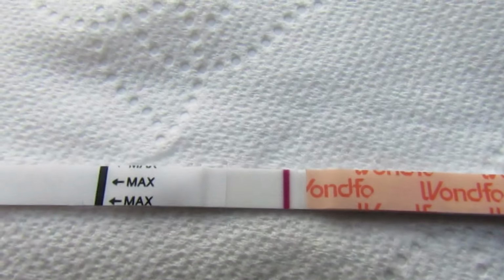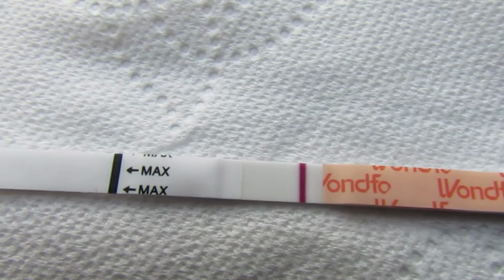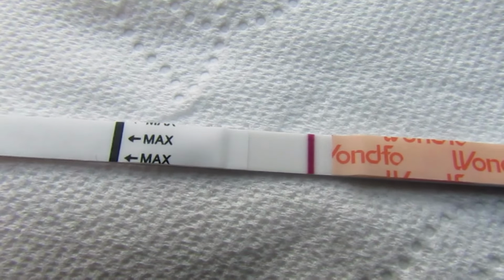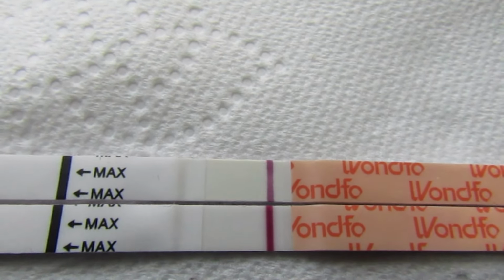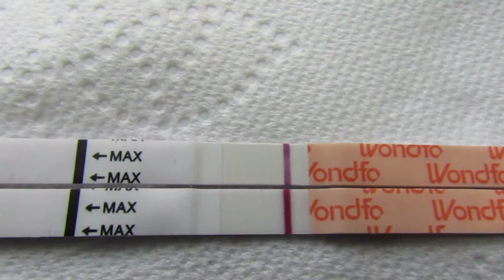Right, I can't say this view is any better. It's not cloudy outside, but the days are getting shorter and it just starts getting darker earlier. This is not a morning test either. This is an afternoon test. Alright, so here is the new test that I just took today. 8 DPO is at the bottom. I brought over my 7 DPO test and put it at the top. You can tell it's the test that's dried up right now. My eyes are playing tricks on me. I feel like I'm seeing something on 8 DPO, but I'm not sure, and I wanted to compare it to 7 DPO.